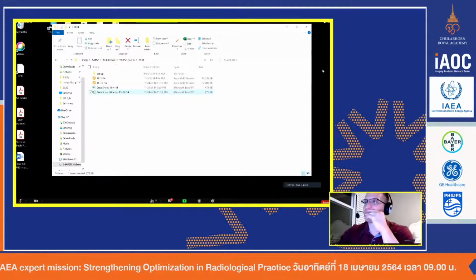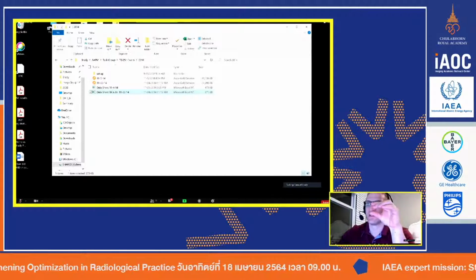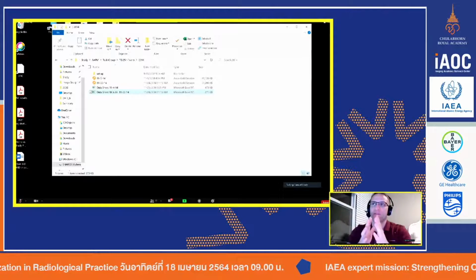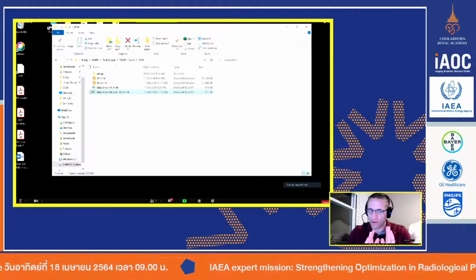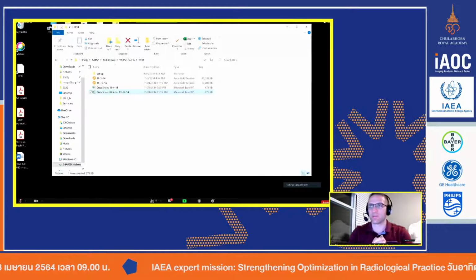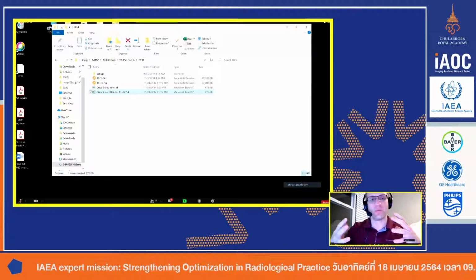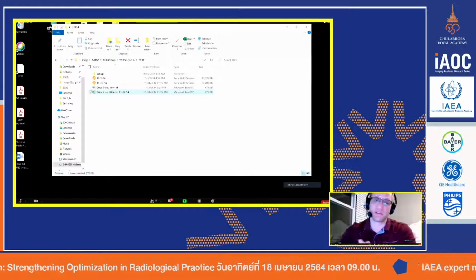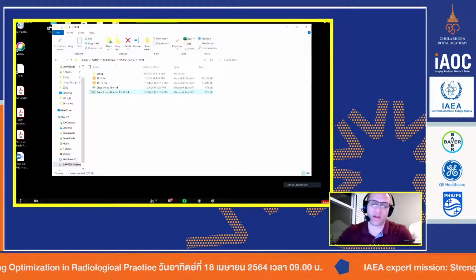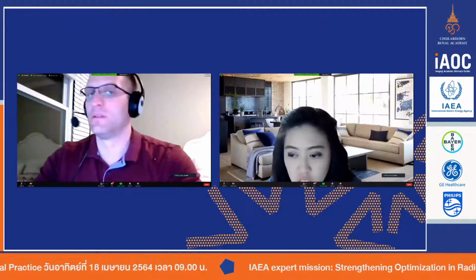That's okay. So next week we can talk more about this. Each block thickness really does approximate a rough thickness of a body. Now, in all fairness, this is mostly for the abdomen. Obviously, when you get to the chest, you have air, so it's a little different. We've had to come up with different ways to make an equivalent chest phantom, but I'll talk about that next time. Sure. So the second question is about the continuous fluoroscopic mode.